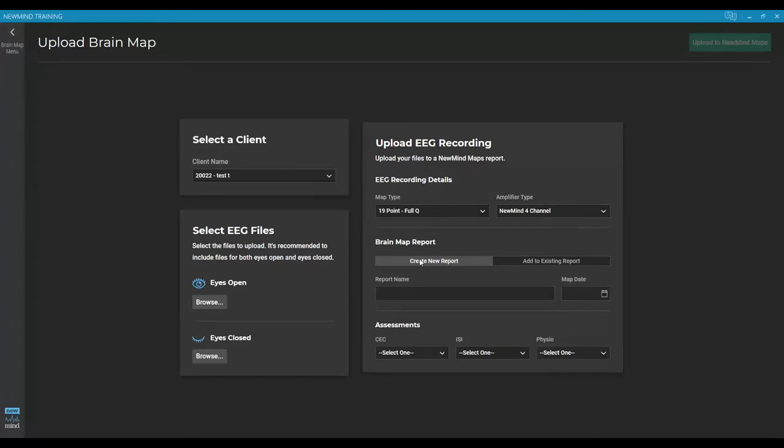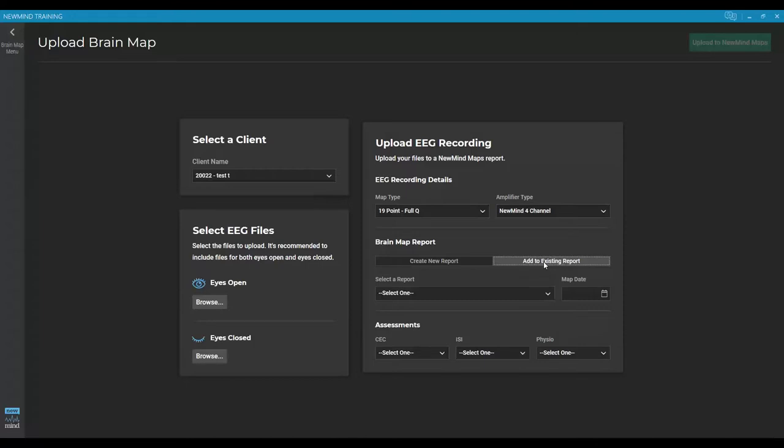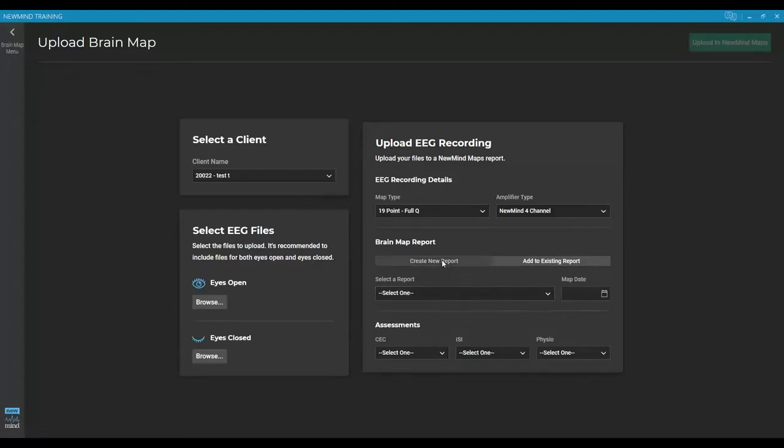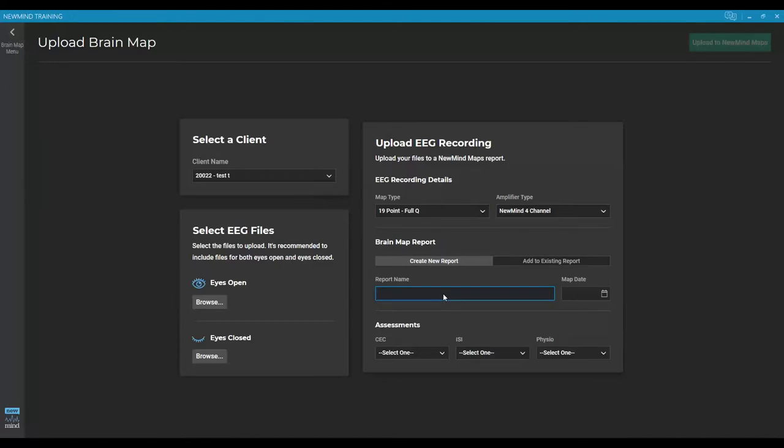Most of the time you are going to be creating a new report. Over here, there is an option to add to an existing report. So this would be if you had already uploaded eyes closed, and now you need to go back and upload eyes open to that same EEG set. You would choose add to an existing and then pick the report name. I'm going to choose create a new report. And for the report name, it doesn't need to include their name or if it's eyes closed or eyes open. Instead, what we want here is just a name that helps let us know when we log into the database what map this was. So I like to just use first map, second map, third map.